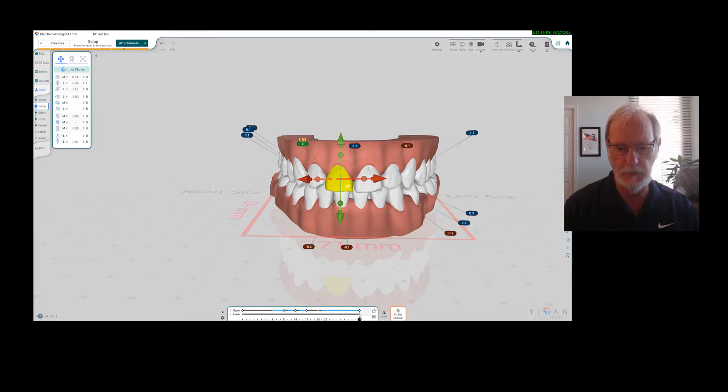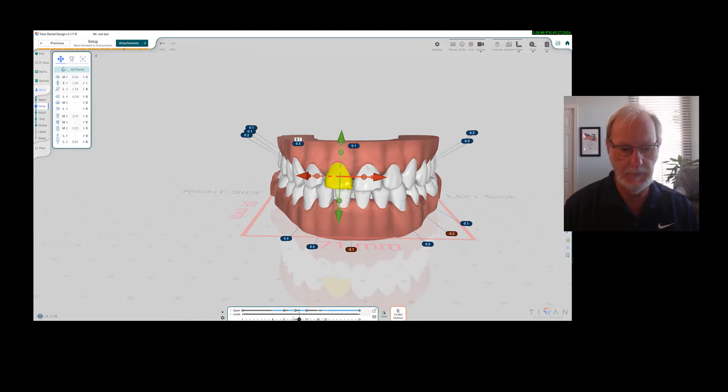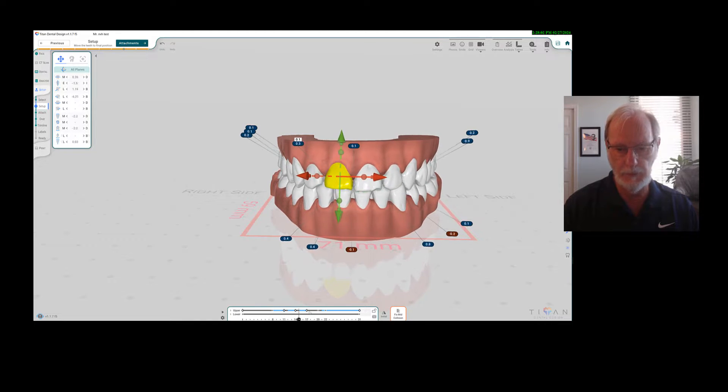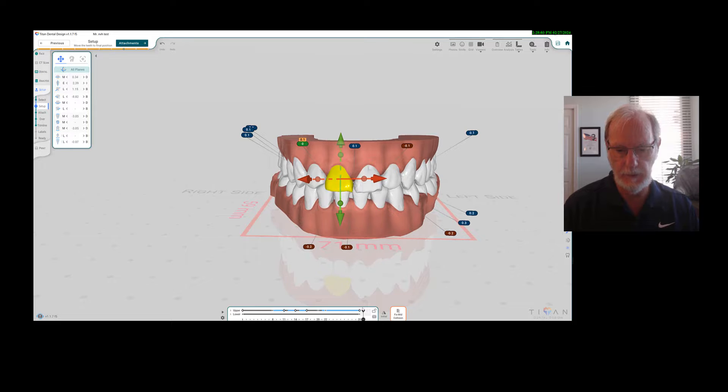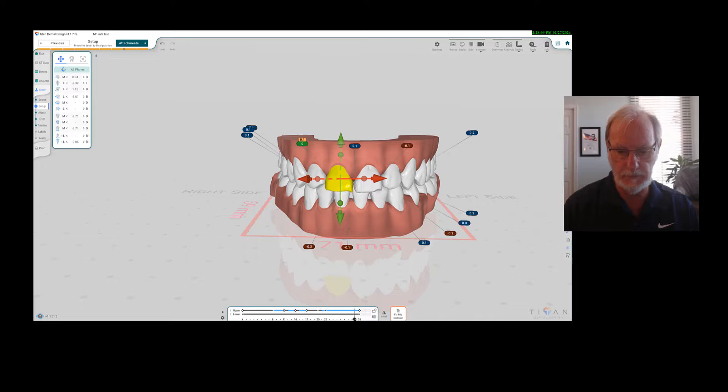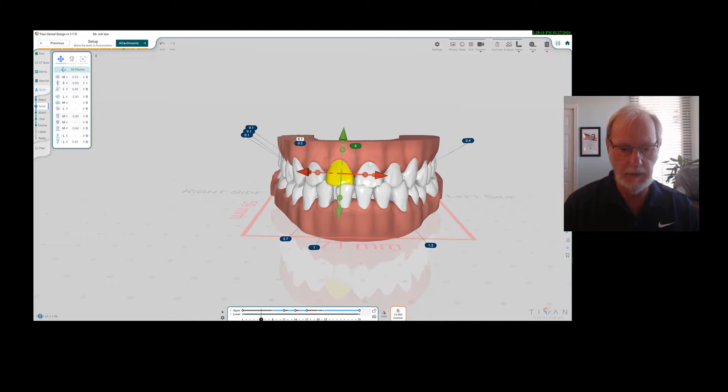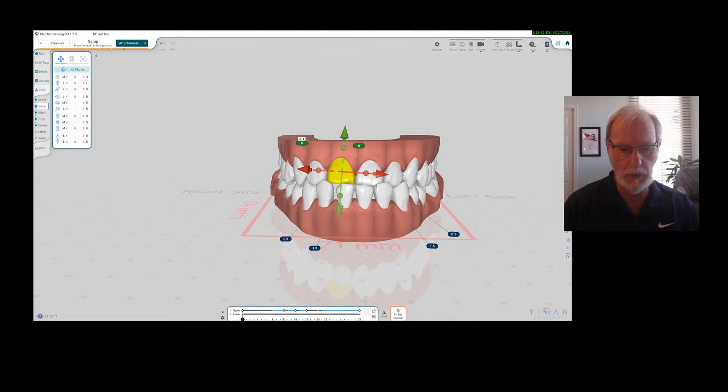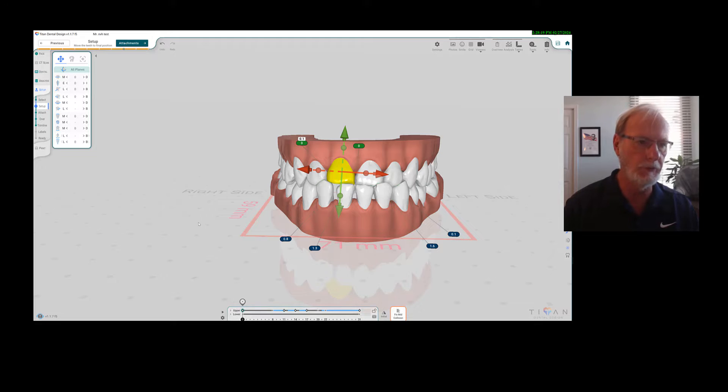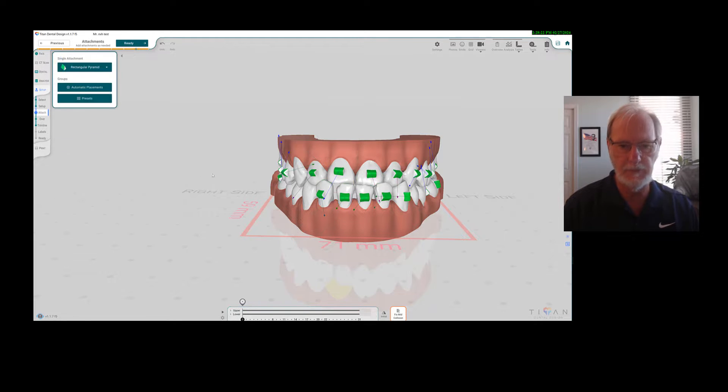It has 31 upper and 31 lowers, and what I've done too is there were less upper than lower, so I asked the software to give me a longer treatment for the upper. So we have 31 and 31, which I like. You can fix the midpoint collisions, and the next step is attachments.